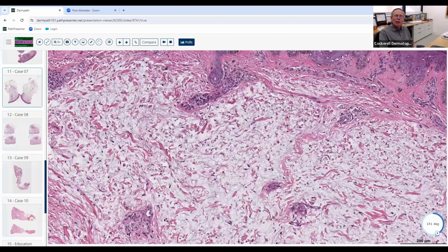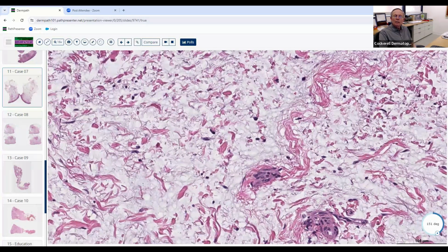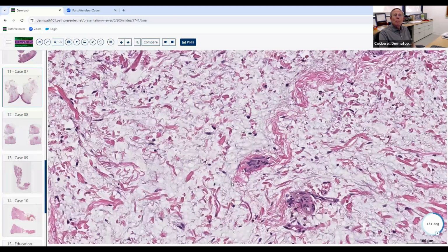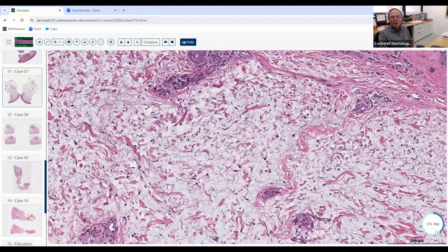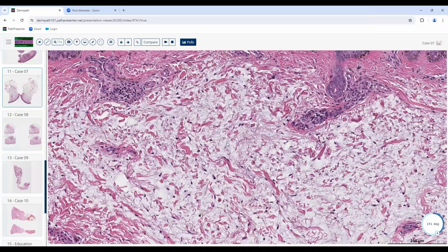Anything else that can look like mucin sometimes, bluish gray like this, that actually isn't mucin? There's two things. One is extracellular lipid sometimes. Of course, if you see somebody that's got an eruptive xanthoma, they get massive triglycerides and it deposits in the skin so rapidly that it's no longer within any cells.